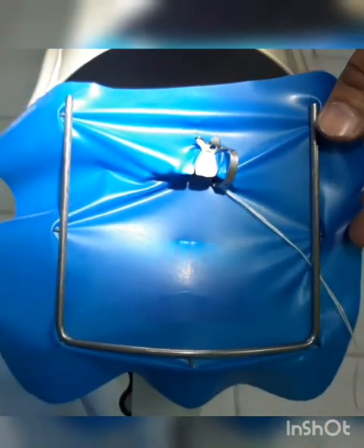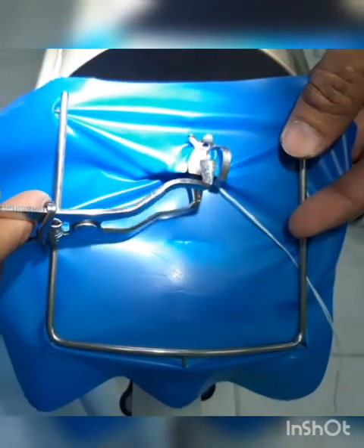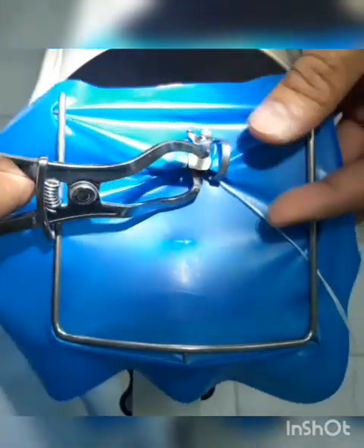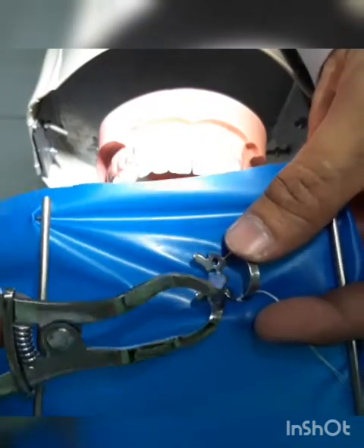After you have placed your temporary filling on the involved tooth, remove the assembly using your clamp holder and then release. That's how you remove your rubber dam assembly.